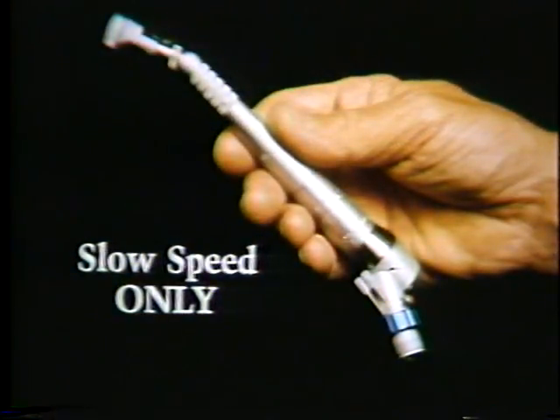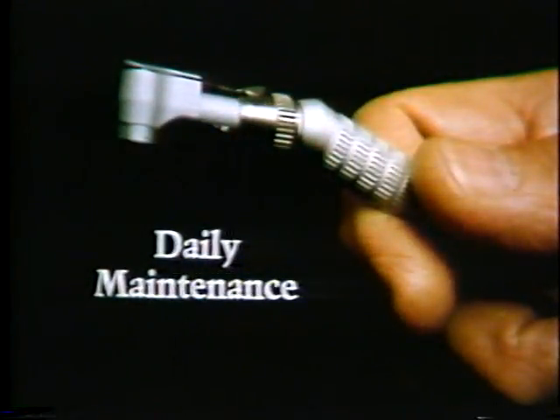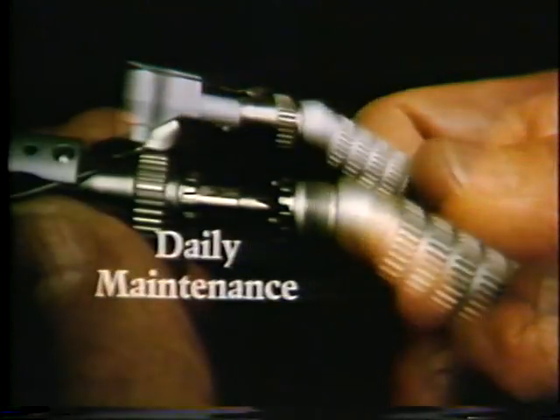The latch-type contra-angle should only be used on the slow-speed shorty motor. There is a shorty motor with 2 speeds, slow and high. You'll ruin the latch-type contra-angle if you use it at high speed. Daily maintenance of the latch-type contra-angle involves these steps.